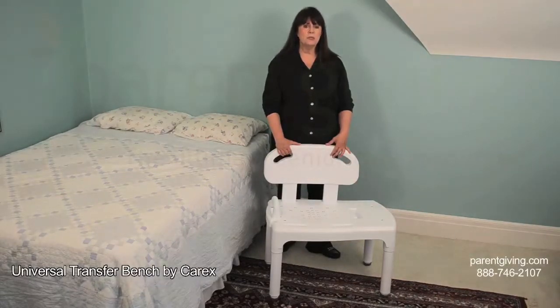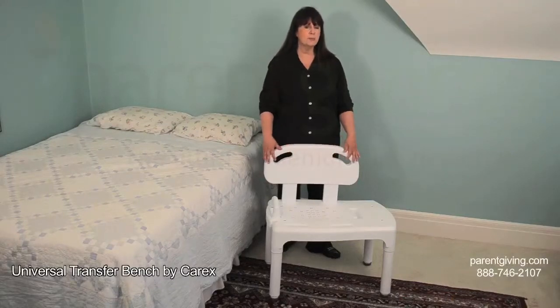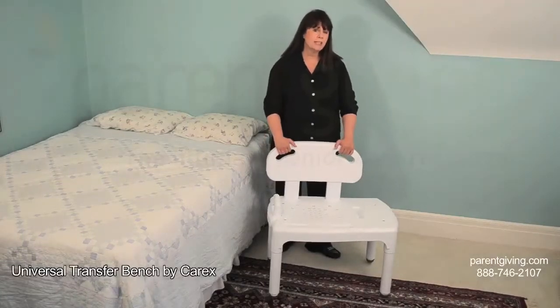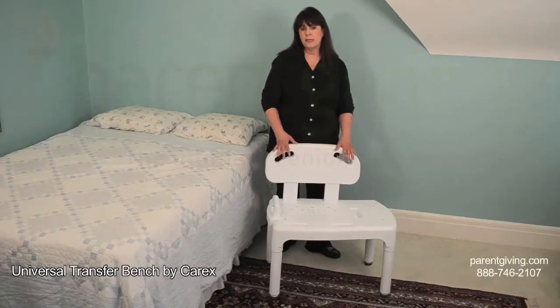This transfer bench was designed and developed with input from occupational therapists and healthcare professionals to make it as functional as possible, so it has great features. The backrest has two built-in handles to make positioning it easier, and the bench can be set up to have the handle on either the left or right side.